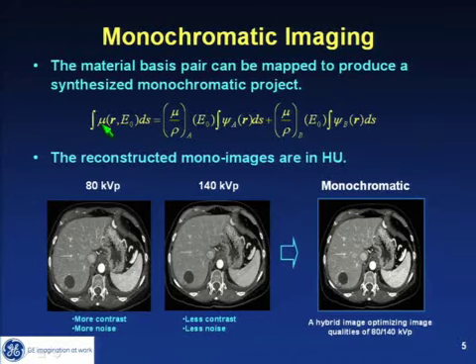This is a projection of the line integral of a specific energy collected along a path. Therefore, if you look at X-ray CT, typically the X-ray photons coming out of the scanner have a very broad spectrum. This is an attempt where we can try to mimic or simulate a set of projections as if the X-ray source had a monoenergetic X-ray coming out.